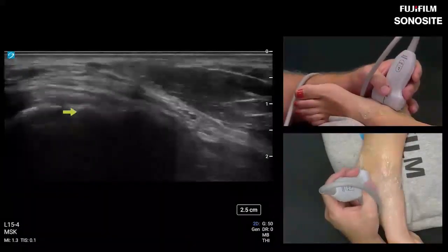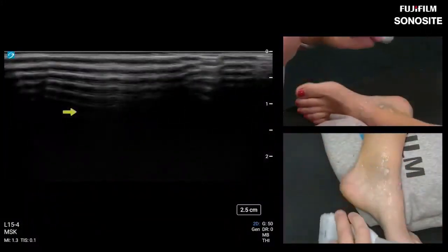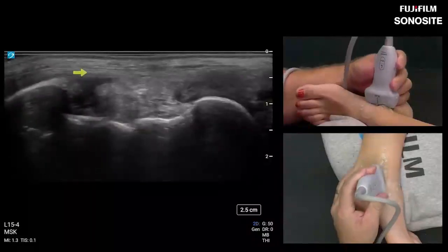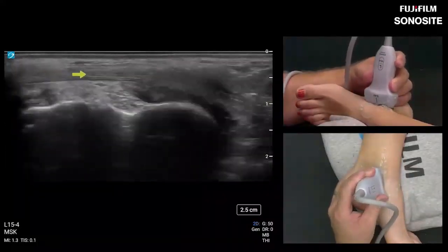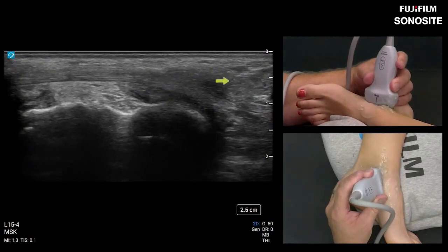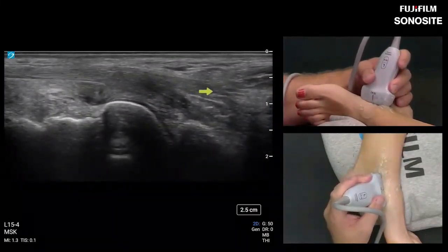All right, so what happens after the malleolar level? Let's go chase those down. I'm going to move all my gel heap around. After the medial malleolus, the tibialis posterior really looks the most complete here. So we see this very broad tendon take a fan shape and grab at the navicular. So it doesn't just attach to the navicular, it envelops the navicular. And here we can see a couple branches of that tendon.